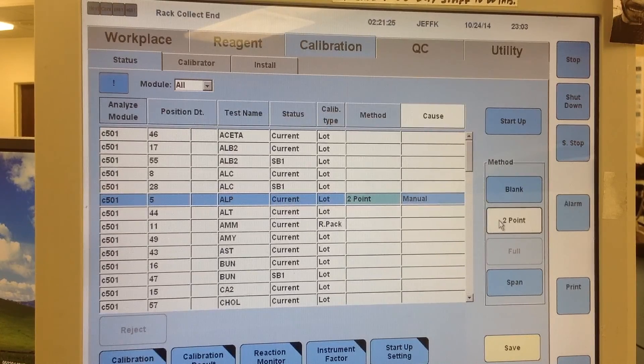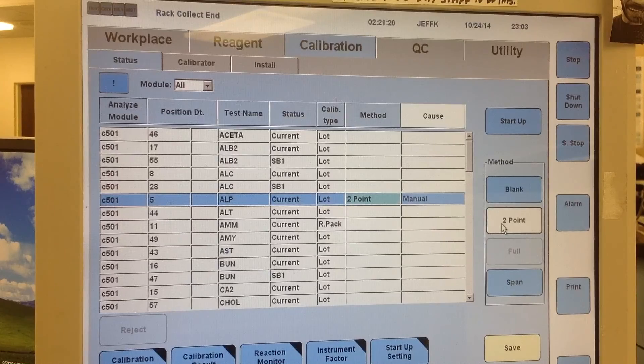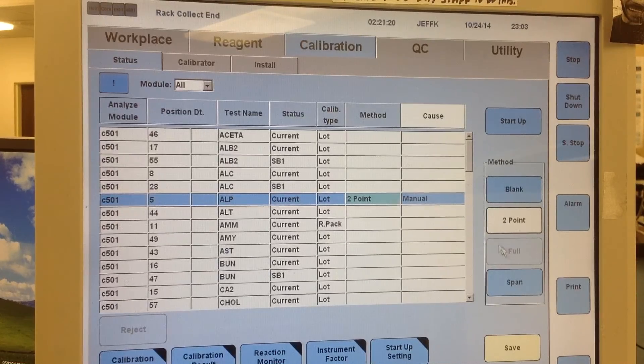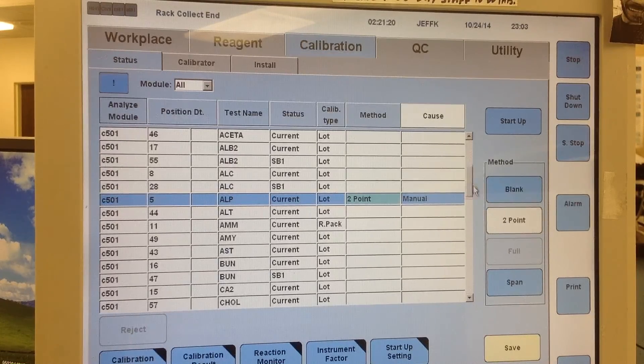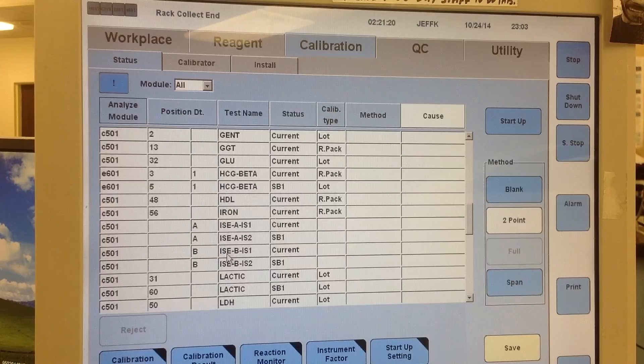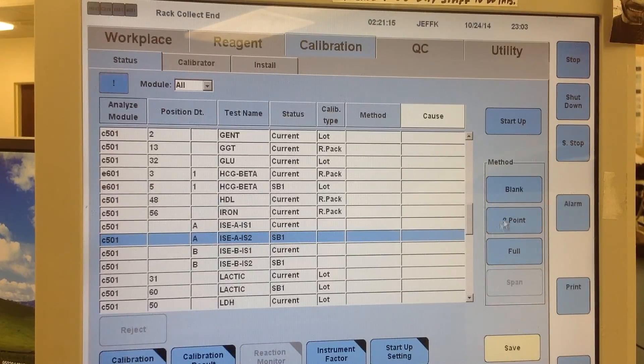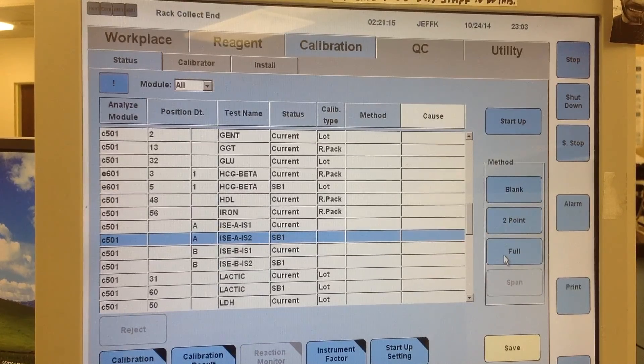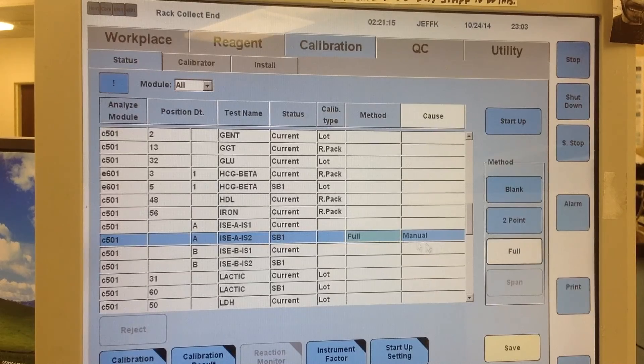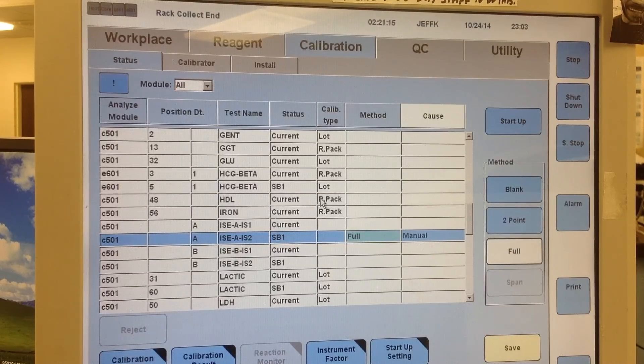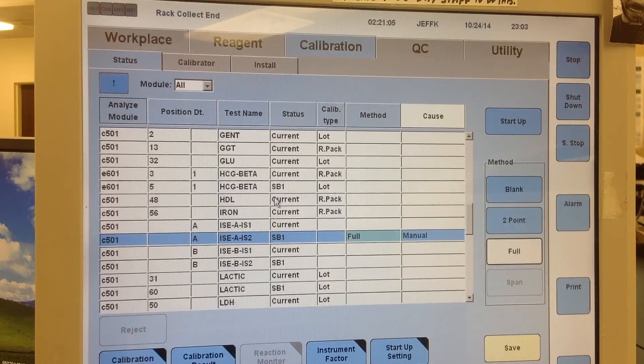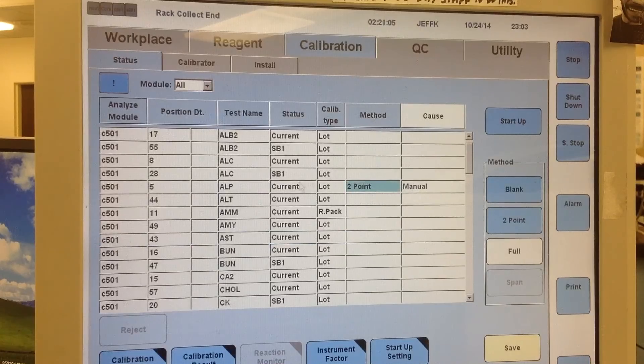Typically, you want to take 2 point if it's available or full if it's available. So for example, on your ISEs, it's going to give you blank, 2 point, full as the option, but you're going to want to order full for ISEs. There's a couple of other tests that will have full.